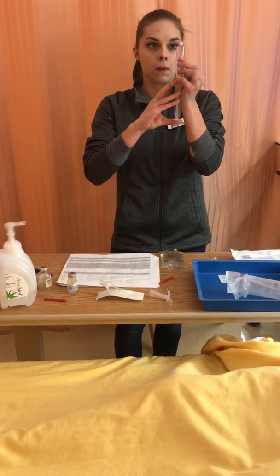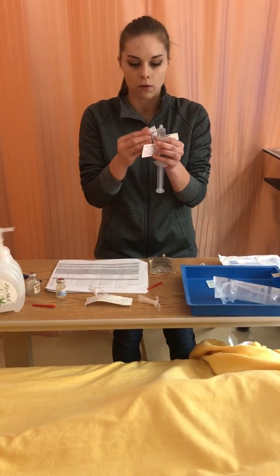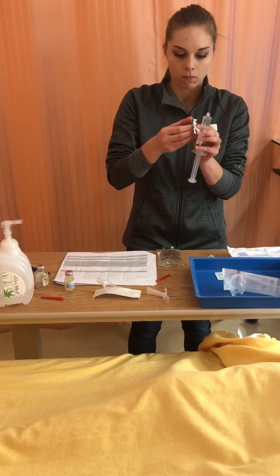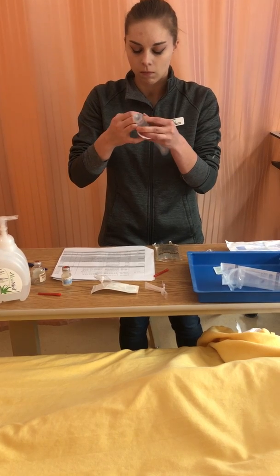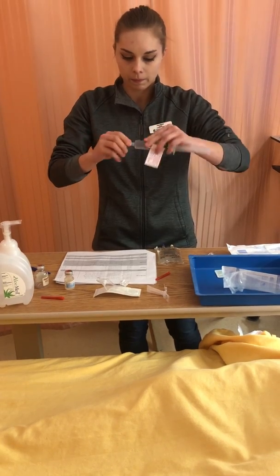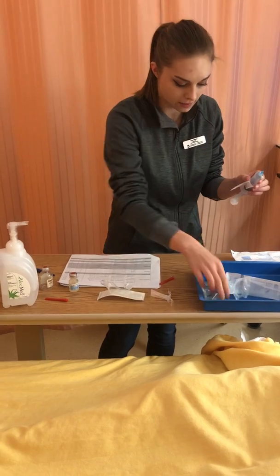I'm going to cap it with a blue cap. For instance, if they say they don't want it anymore, in that case, we can provide an alternative to the antibiotics which they are taking. I'll be evaluating them after some time to make sure that the medication is working and watching the signs and symptoms. So now I'm ready to head to the bedside.